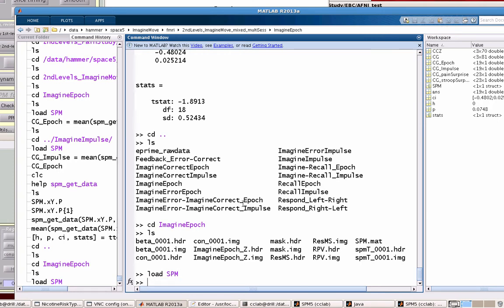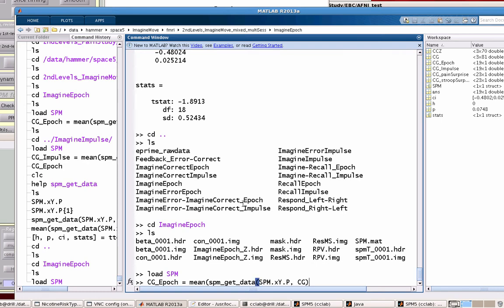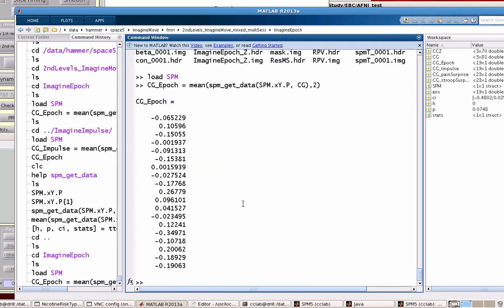So I load SPM and let's say I want to call this CG_epoch. That equals just what I typed in before - the average across that ROI for all the subjects. So mean SPM_get_data, SPM.xY.P, CG, and averaging across voxels. So I have that.